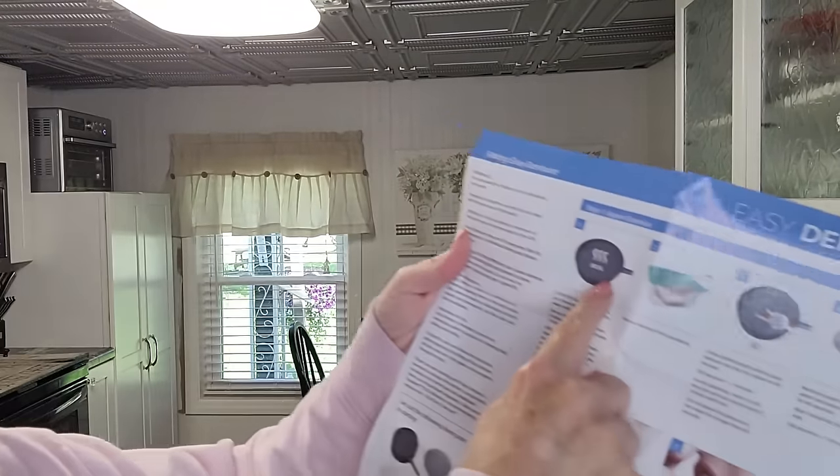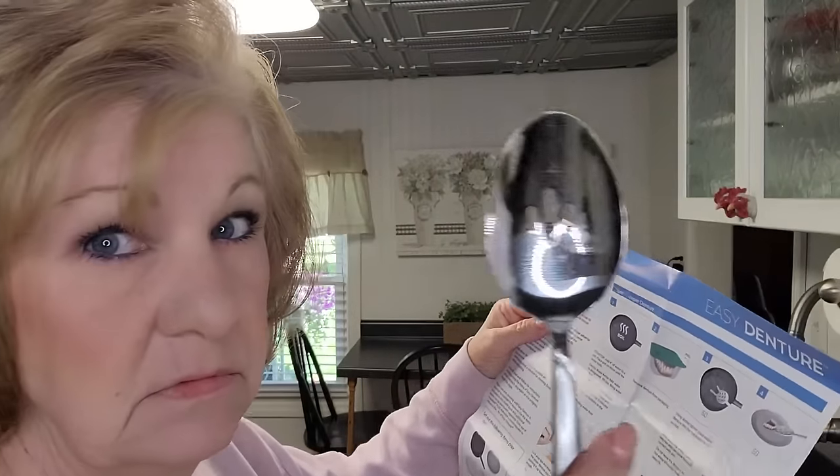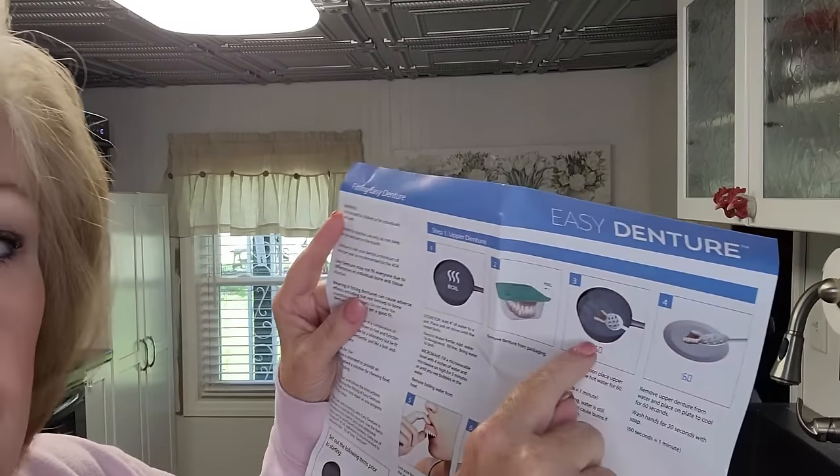While my water's boiling, the instructions cover either the stovetop, the microwave, or an electric kettle. I put four inches of water in a bowl and put it in the microwave for five minutes. When the water's ready, you get a slotted spoon, put the denture into the water and leave it in there for 60 seconds. Then you scoop it out, put it on a plate and wait until it's cool to the touch — warm and pliable, but not hot so it burns you.